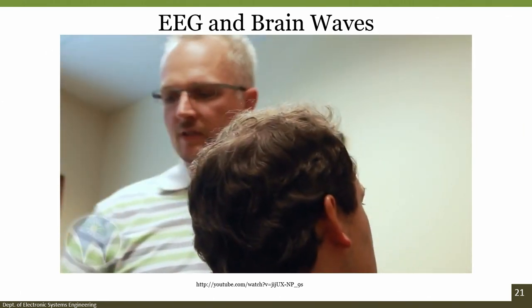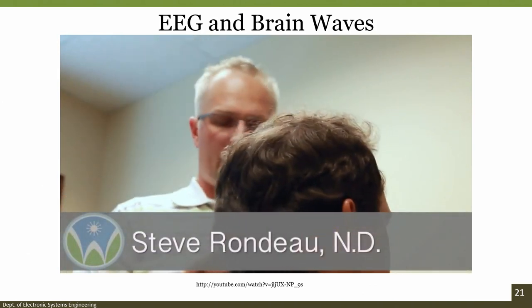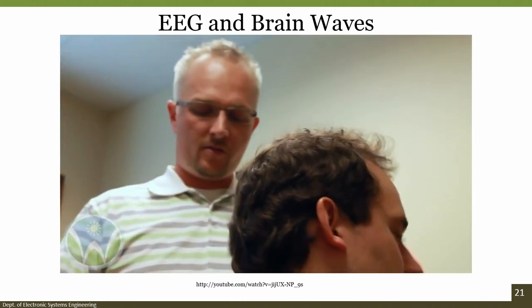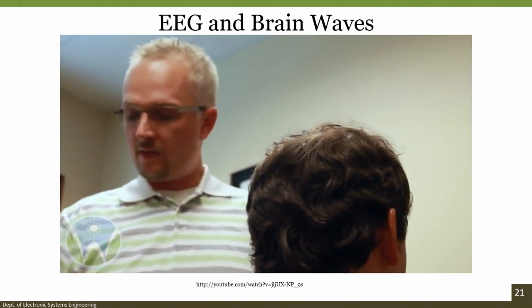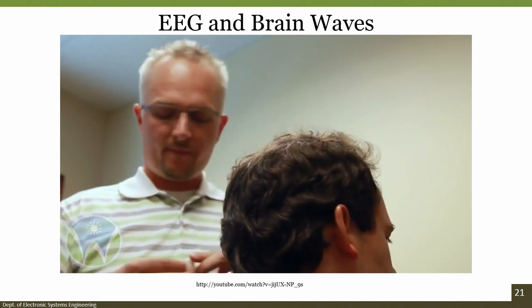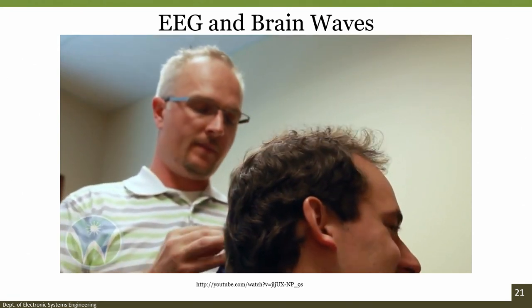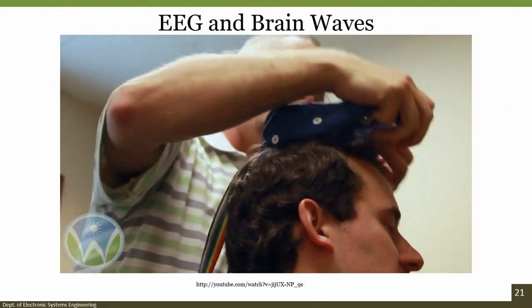So we're going to be recording your EEG today. And so essentially what we're going to do is put this swim cap over the top of your head. Doesn't have any feeling associated with it or any encumbers. It's just a pretty easy process. Okay. Put these little foam sponges on these here. And now the cap will go over your head. Okay. This is the hardest part of the whole process, is right here. This cap goes right over the top of your head, just above your eyes.